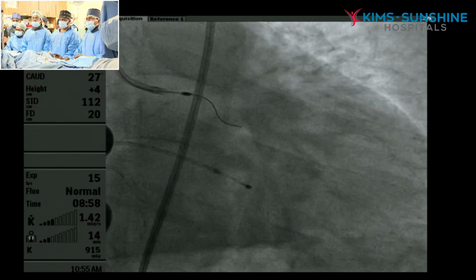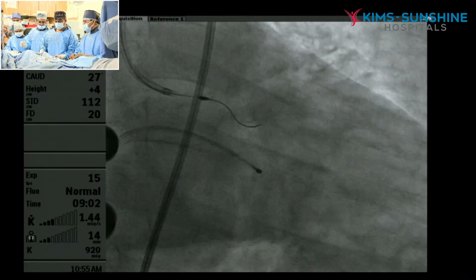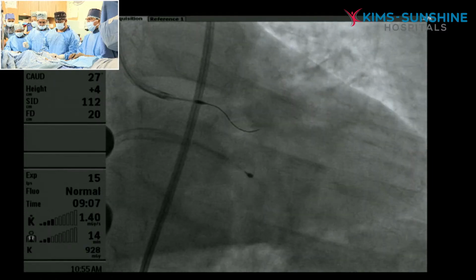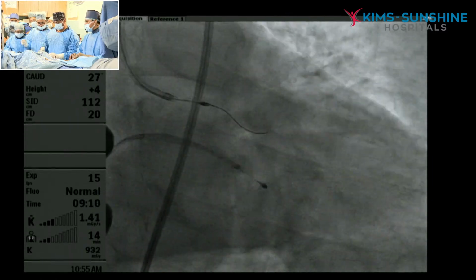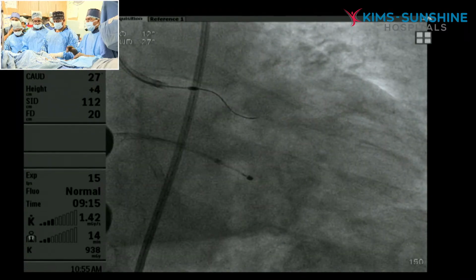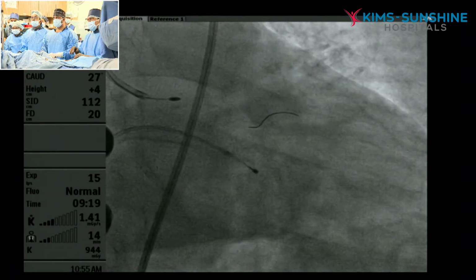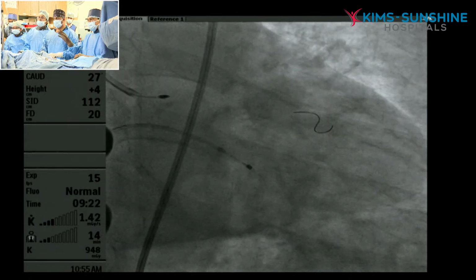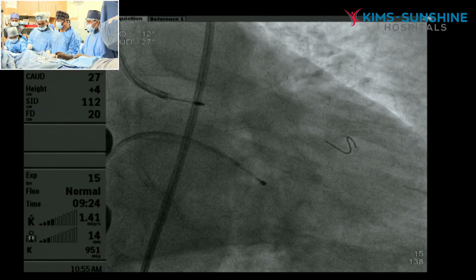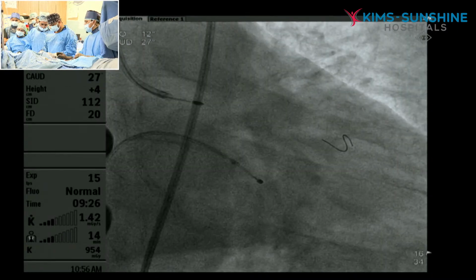Put the Dyna on the wire and push the wire. Now Dyna on, and then press break defeat, remove it and advance the wire. Press is defeated. Now you press both. Both, sir. Press this and push the wire. Dynaglide light, the wire will go now. That's enough, leave it. On Dynaglide it will go easily. Now you can hold it, that's enough. It a target, keep it there, no need to park into that.